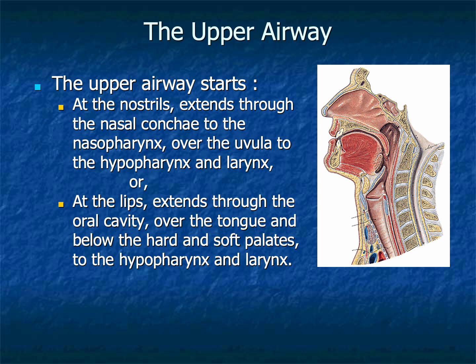Airflow changes with breathing. Tissue positions change with swallowing and phonation. Even patient anxiety can alter muscular tone and airway configuration. The bronchoscopist, therefore, learns anatomy not from diagrams alone, but from living movement.